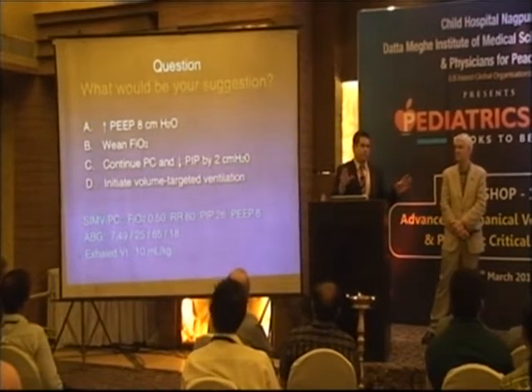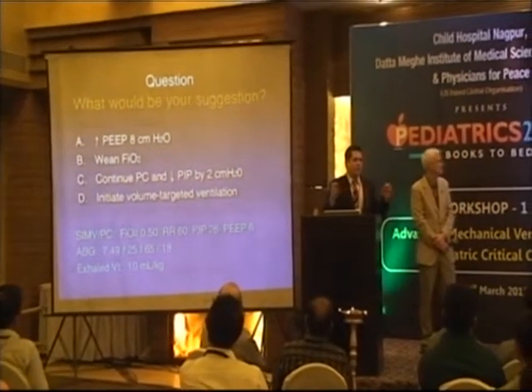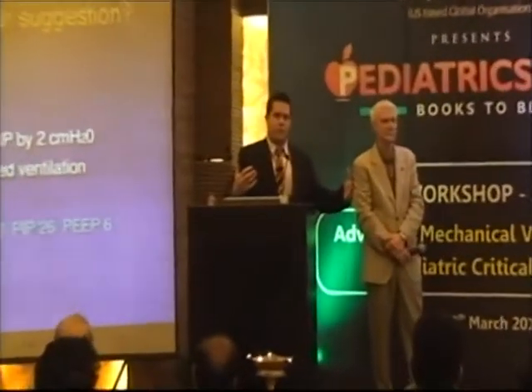That's my goal. Okay, we want to try to introduce to you some new ventilator approaches that can result in less injury to the lung. Volume targeted mechanical ventilation is one of those that now we've learned from the adults. Ed Karakin mentioned earlier that we extrapolate oftentimes from the adult studies. Well, we've done that, and we found that based on the ARDSNet approach, it's better to target tidal volume than it is to target pressure, because it's really the volume that's going to cause lung injury in these patients.